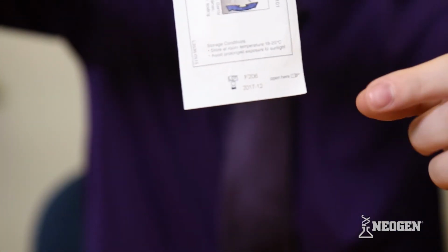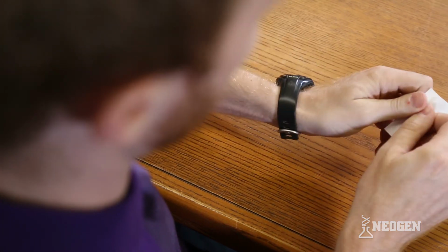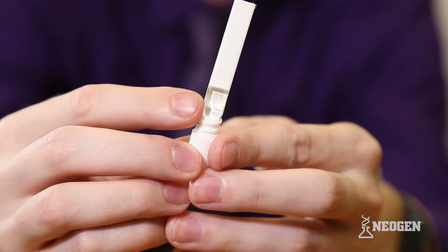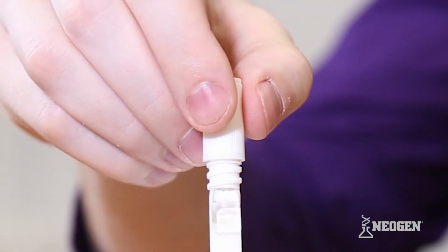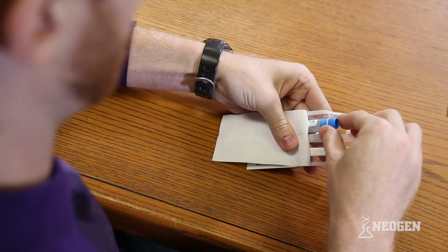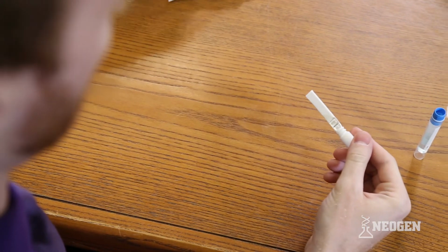4. Have the donor inspect the expiration date on the device, and then open the packaging and remove the NeoSal using the white plastic handle. The donor should be careful not to touch the pad or have the pad touch any surfaces. The SVAI will have a visible line in the clear plastic window prior to collection of the sample. This line will turn blue when sufficient sample has been collected. 5. While holding the white plastic handle, the donor should take a few seconds to pool or accumulate saliva prior to inserting the NeoSal in the mouth.